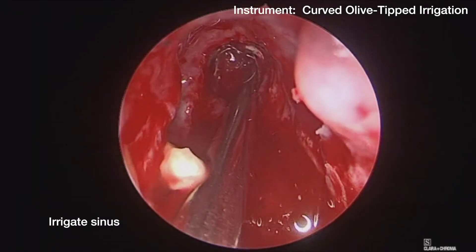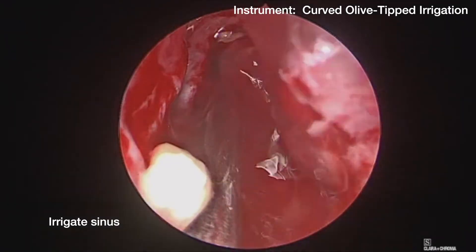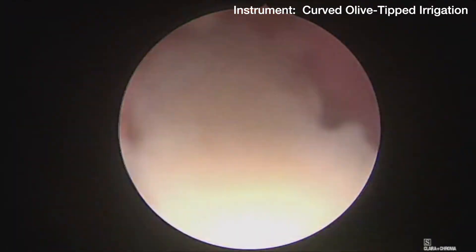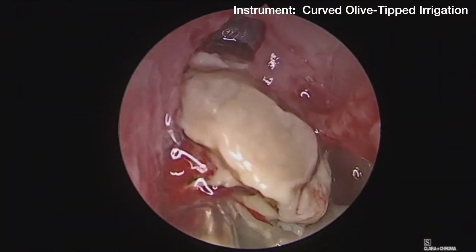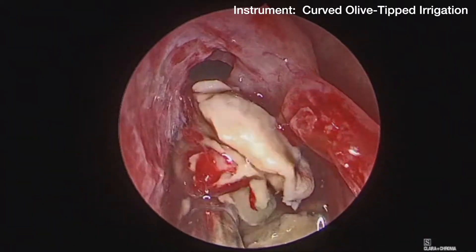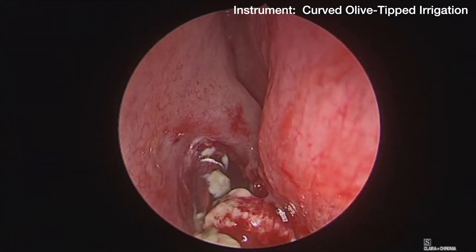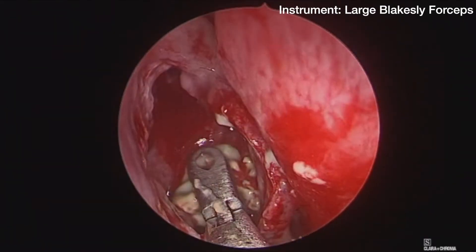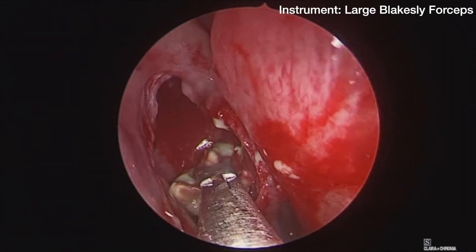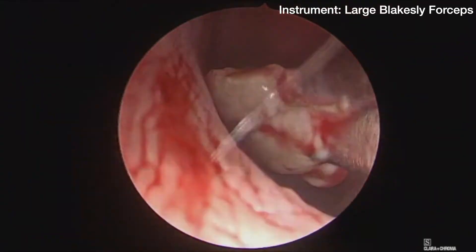Flushing the sinus with sterile saline is often very successful at getting behind the fungus balls and removing the debris, as shown here. Additional specimen is collected and sent for pathology or simply suctioned away.